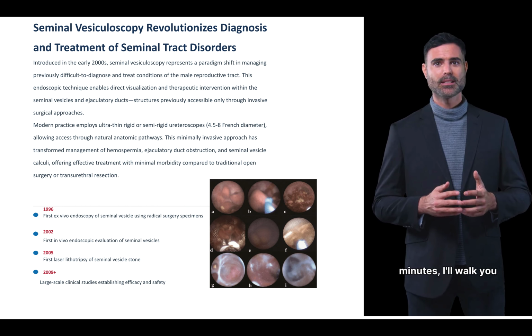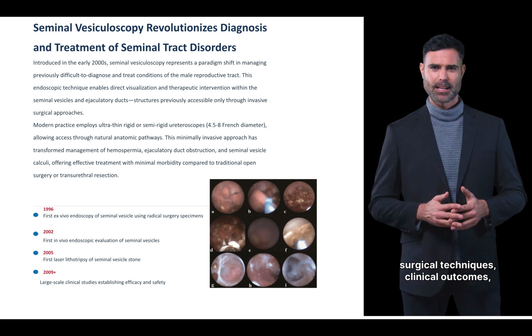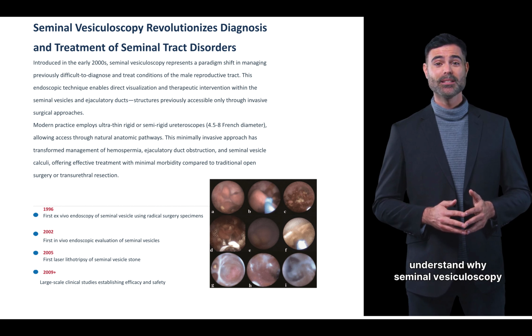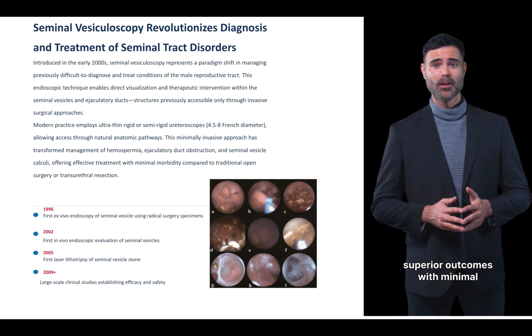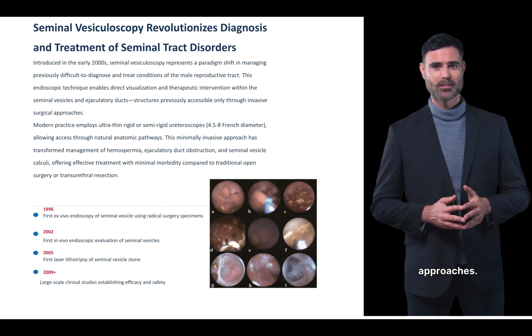Over the next 10 minutes, I'll walk you through the anatomical foundations, surgical techniques, clinical outcomes, and future directions of this procedure. By the end, you'll understand why seminal vesiculoscopy represents a significant advance in men's healthcare, offering superior outcomes with minimal complications compared to traditional approaches.